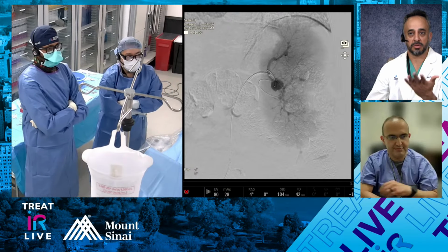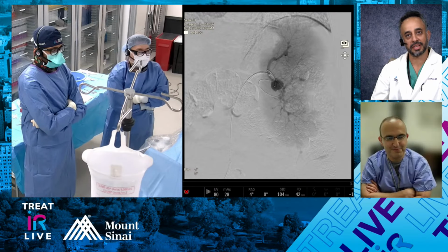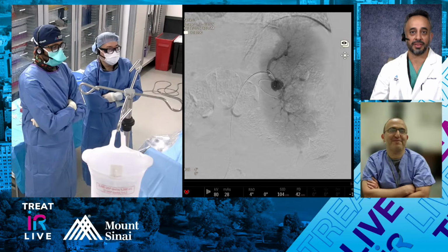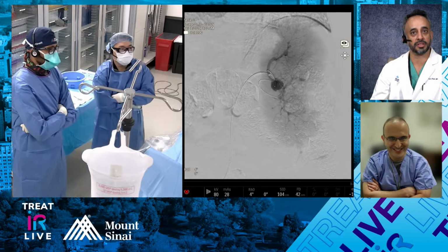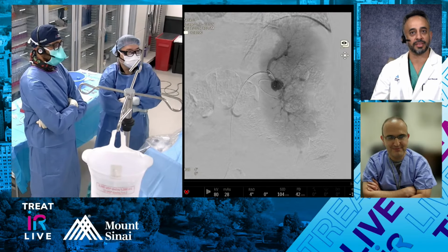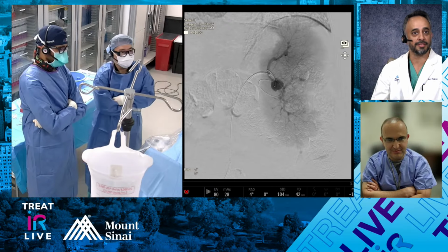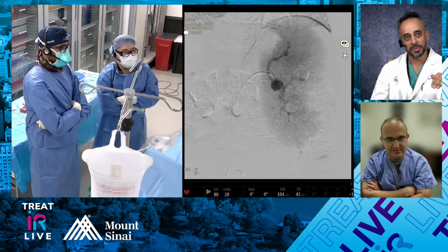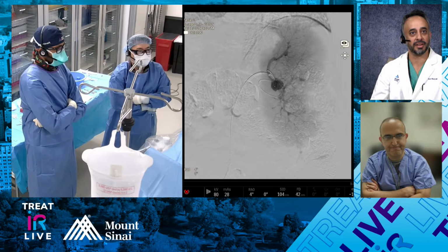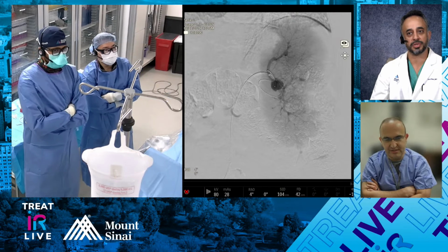I don't know if Dr. Cohn has any different feelings on it, but it always looks like, oh, this would be a great case to do a stent or try to put out a covered stent. And when you get there, there's no way, given all that tortuosity, if you look at just the microcatheter whipping around back and forth there, there's no stent that's going to track out there that's going to be big enough to do that. And especially trying to get a Viabahn or a VBX out there. It's very proximal. That's probably where you could do a stent, and then it's sort of pointless at that point, right? Because it's so proximal, it's just easier to coil. What are you trying to preserve at that point?